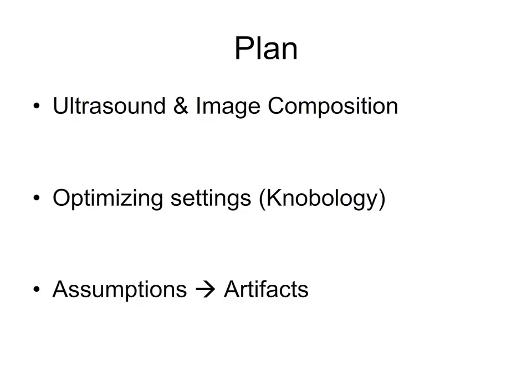So to outline this module, we will start off with ultrasound and image composition, then move to the knobology so that you can become familiar with optimizing settings, and finally, discuss ultrasound assumptions which can lead to the production of artifacts.